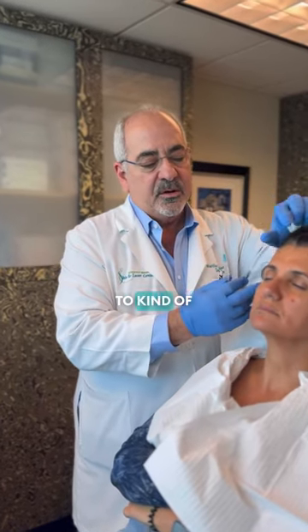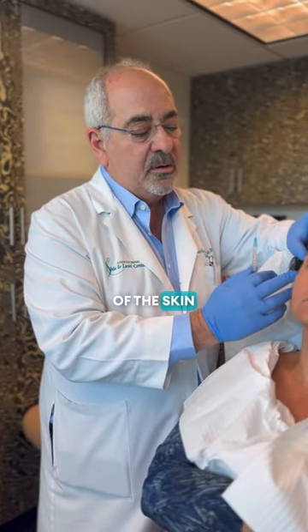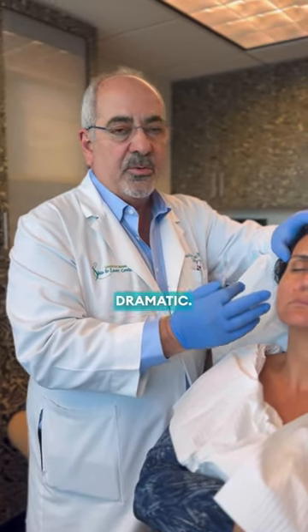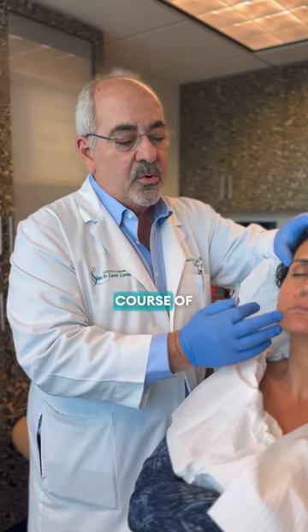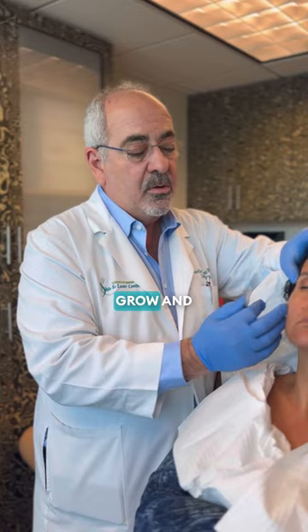The concept is to restore her youthful look, restore the texture and the volume of the skin without making it so dramatic. It's a slow process that over the course of the next two to three months, as we do the transition, we'll continue to grow and improve.